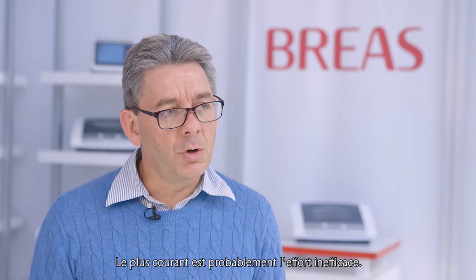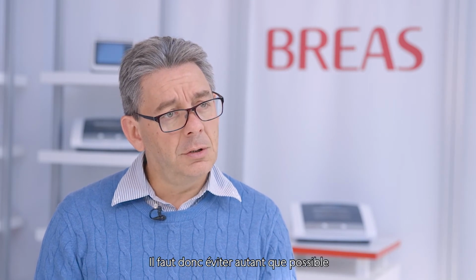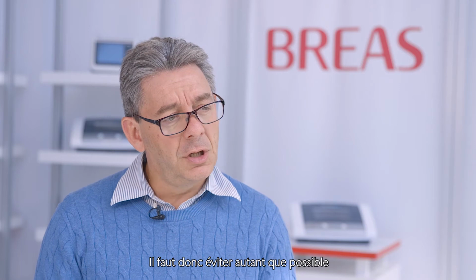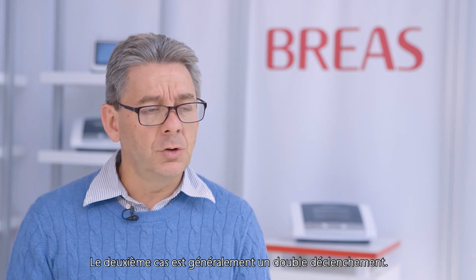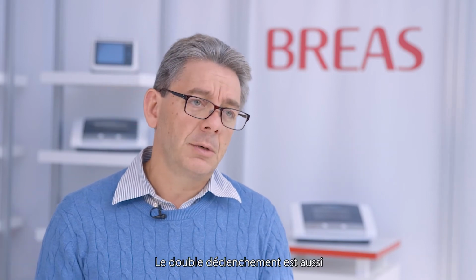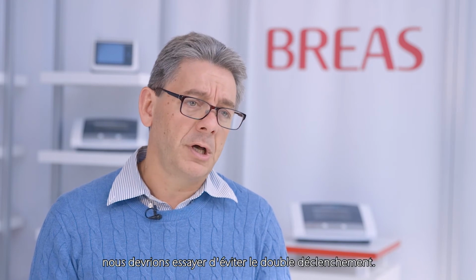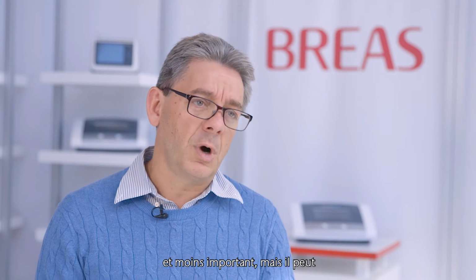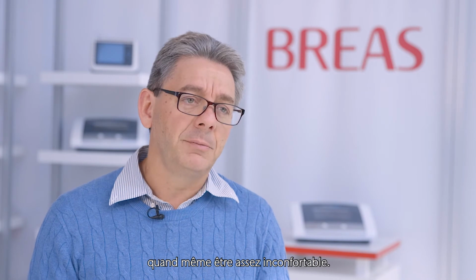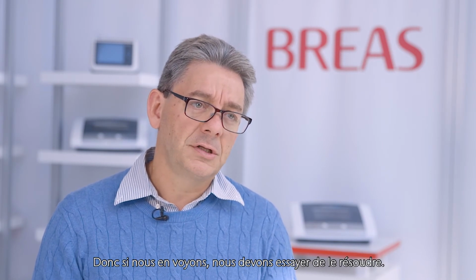Well, probably the most common is ineffective effort. So ineffective effort probably should be avoided as much as possible. The second one usually is double triggering. Double triggering is also very common, and it's very uncomfortable. So that's why we should try to avoid double triggering. Auto triggering is a third one. It's less common, less important, but still can be quite uncomfortable. So if we see some, we have to try to solve it.